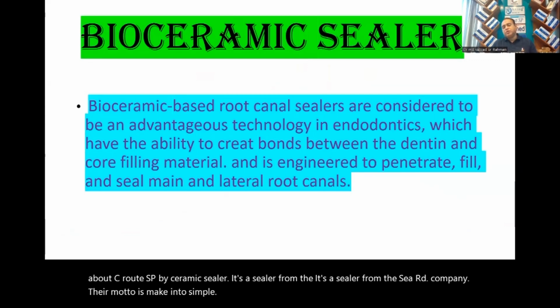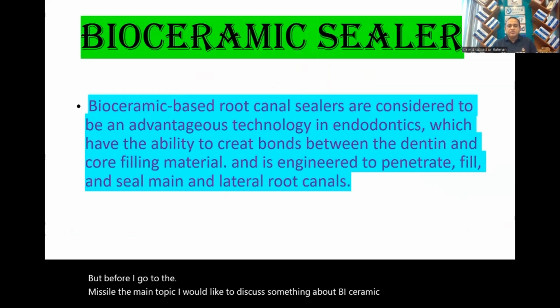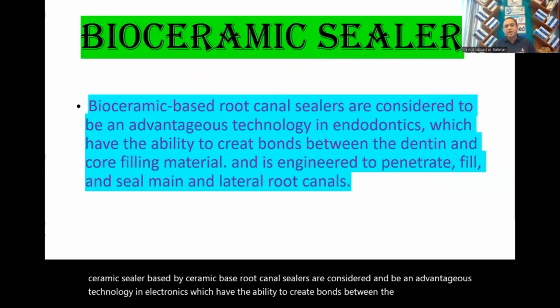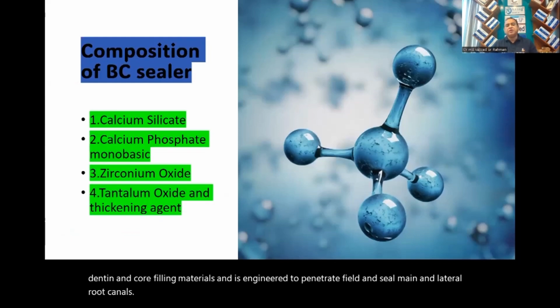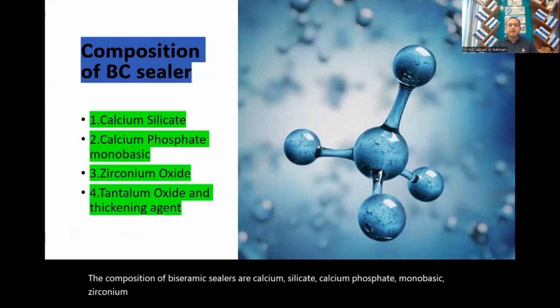But before I go to the C-Root SP bioceramic sealer, the main topic, I would like to discuss something about bioceramic sealers. Bioceramic-based root canal sealers are considered an advantageous technology in endodontics, which have the ability to create bonds between the dentine and filling materials and are engineered to penetrate, fill, and seal main and lateral root canals. The composition of bioceramic sealers is calcium silicate, calcium phosphate monobasic, zirconium oxide, tantalum oxide, and thickening agent.